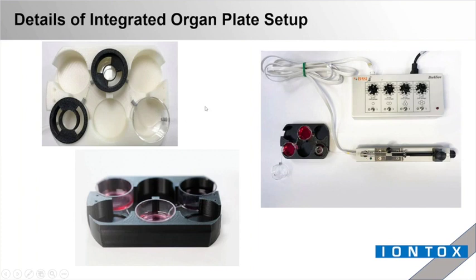So the parent that we apply to this tissue will then go into the basolateral media and then be carried into this cup where, again, by diffusion kinetics, it diffuses out into the compartment over time, and then metabolites and/or parent can also diffuse back into this system, be carried into the next cup, and so on. So each tissue is in its optimal media, and parent compound and metabolites are carried through the system through this semi-permeable membrane.